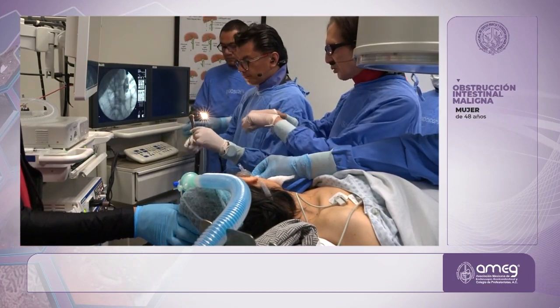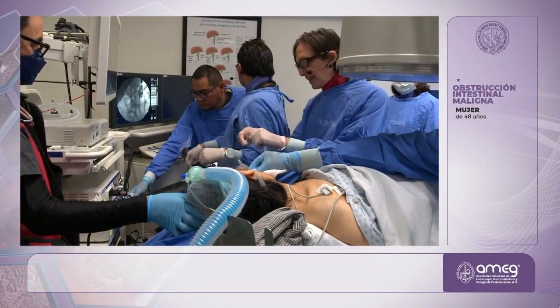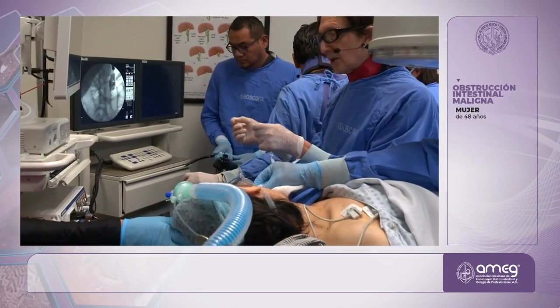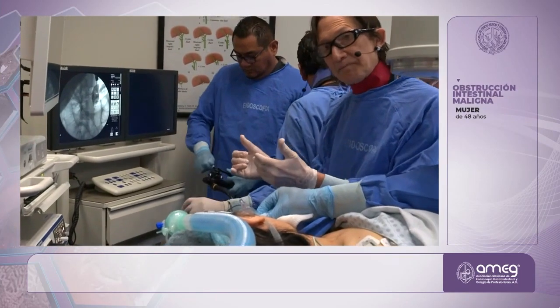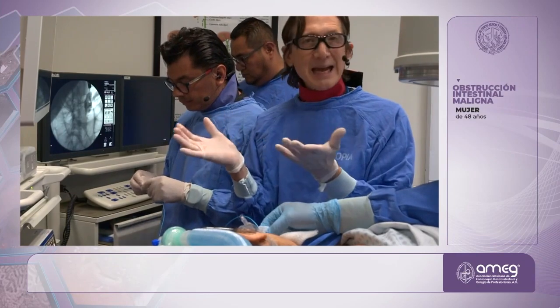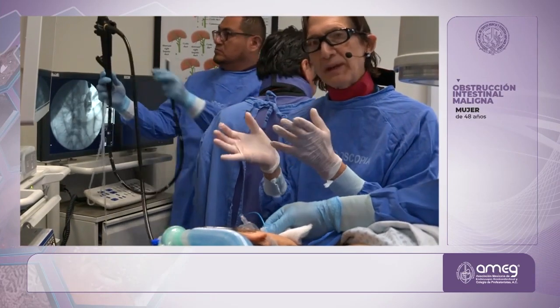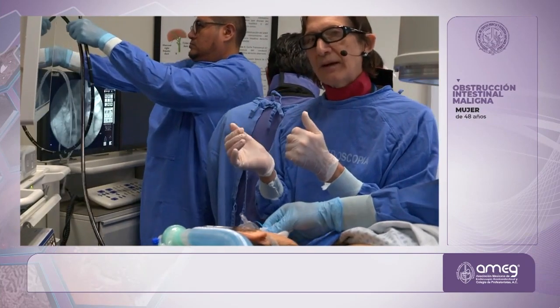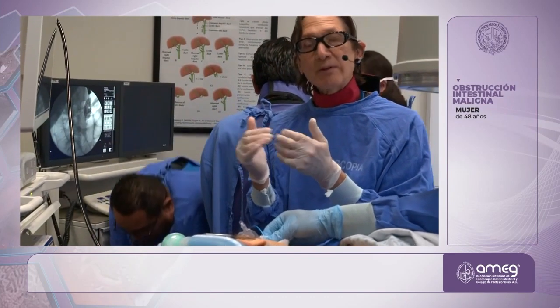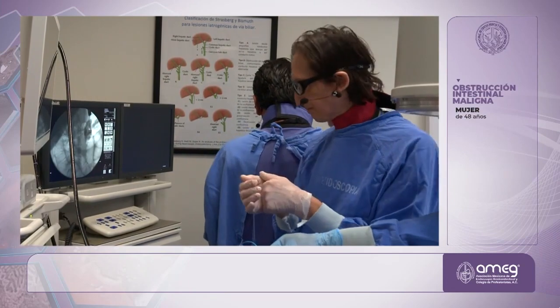All right, now we're going to attach the oral enteric catheter to the pump. So we're going to screw the pump in there. The wire is out, and we're going to use the adapter, and we're going to connect the pump to the oral enteric catheter. And then with my foot pedal, I can infuse saline, and we're going to mix it with some dye, methylene blue or indigo carmine, whatever you want, to give it a little bit of color so that when we create our gastroenterostomy, we have immediate confirmation that we have accessed the small bowel, the target.